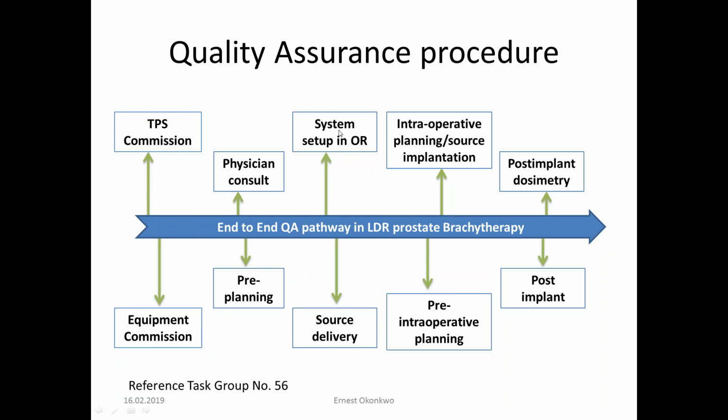Then moving on to the system setup in the operating room. You want to be sure that all the different equipment is well connected and that nothing goes wrong during the procedure, because the patient is anesthetized. You don't want a situation where the ultrasound is not working, or the TPS is not picking up the images from the ultrasound, or you cannot change from the longitudinal view to the axial view.